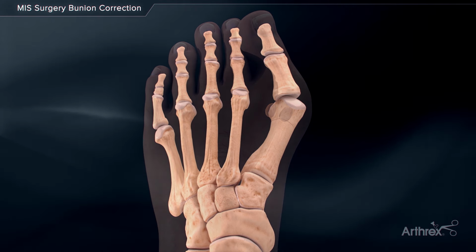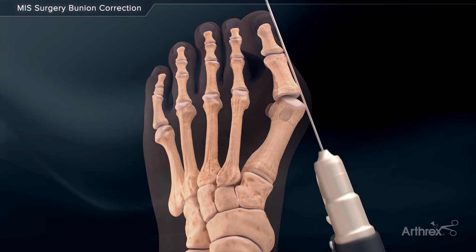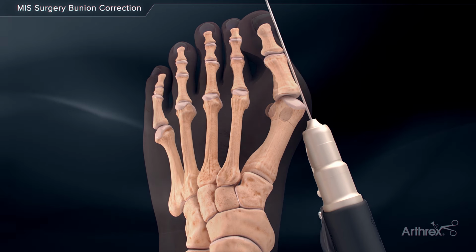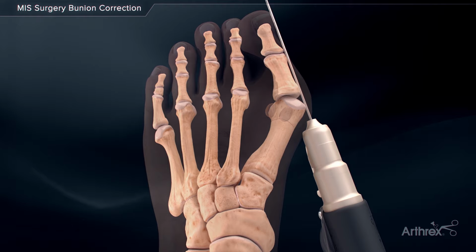complete. Next, a 2 mm double-tipped guide wire is placed antegrade through the incision towards the distal aspect of the toe in an extraperiosteal fashion. The pin should exit the skin midline and medial to the distal phalanx.